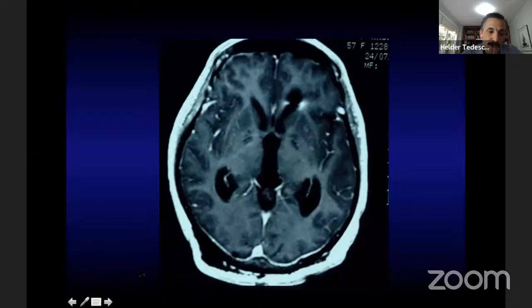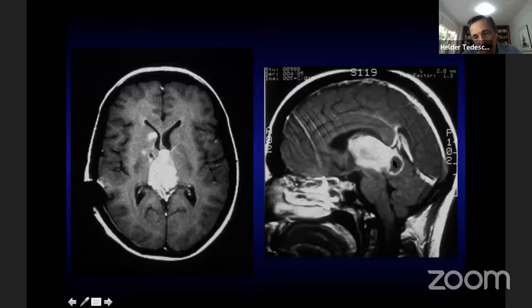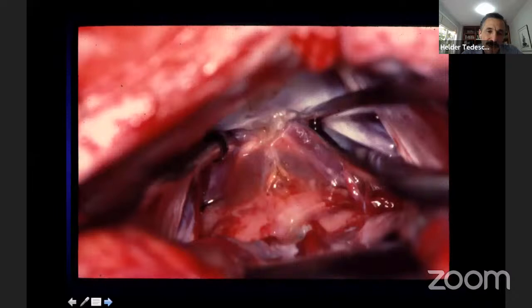Same. Look at this. This is a straight shot here. We can go supracerebellar. This is good. I have no question that towards the midline, you have both walls of the third ventricle in your view.